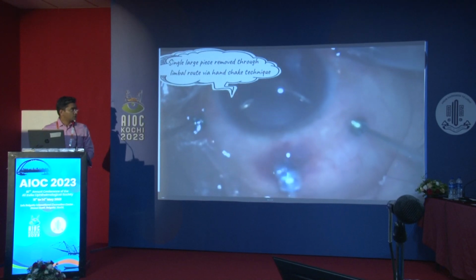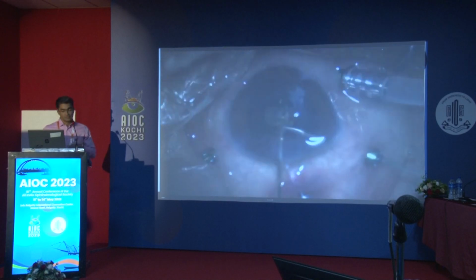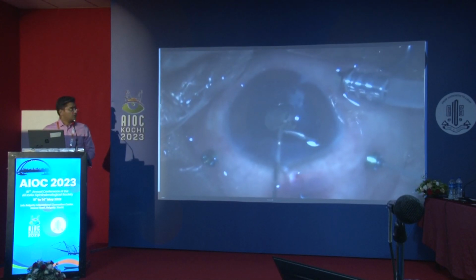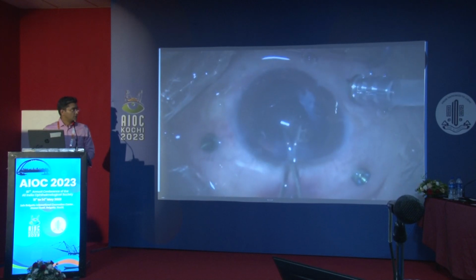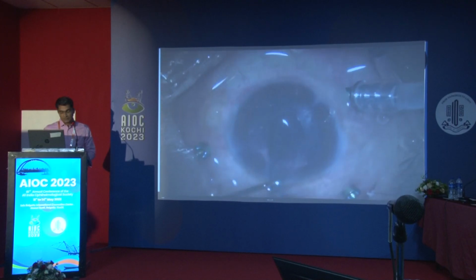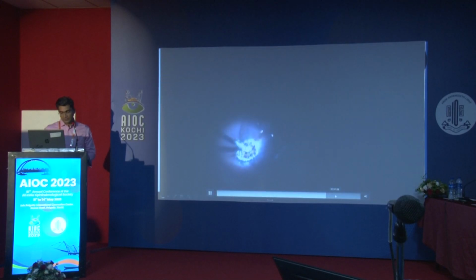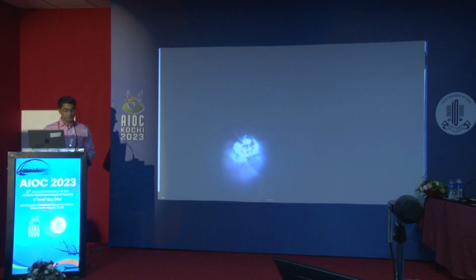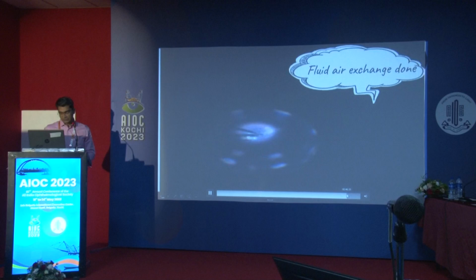So right now, once it is out, I'm keeping it in between the scaffold, where the anterior capsule and the posterior capsule are there, and then using the handshake technique to take it out, aligning the foreign body in the long axis and taking it out from the phaco tunnel itself. Once this was out, we placed the lens. The rest of the area was very chalky, with small fragments, which is probably the rust around the foreign body. That was also removed, and then the inverted ILM peel was done, and the case was closed with gas.